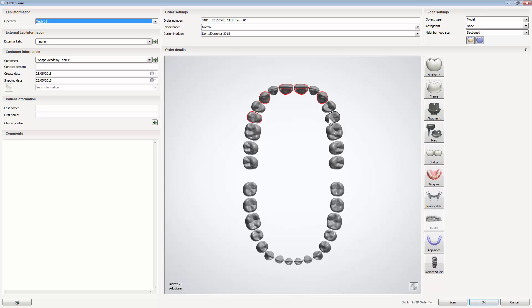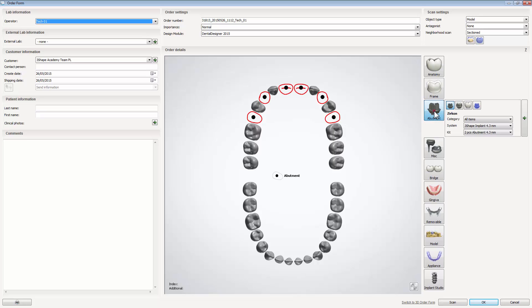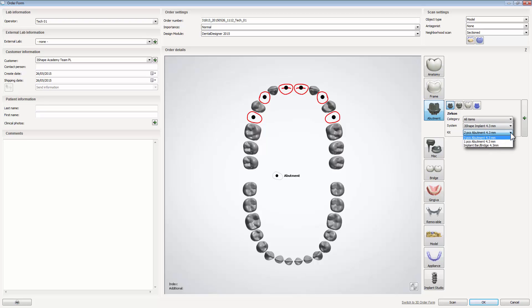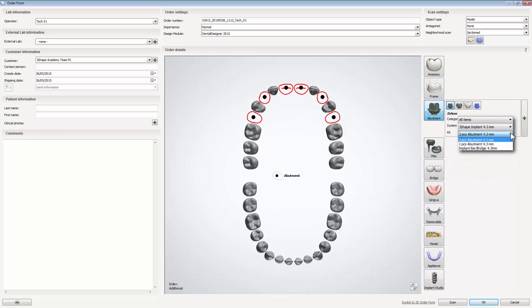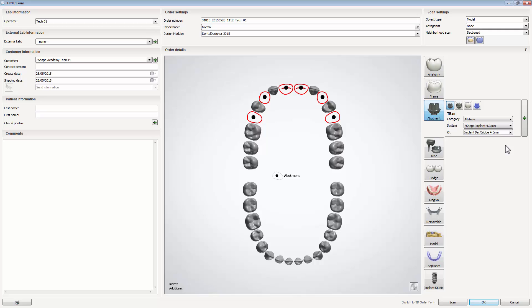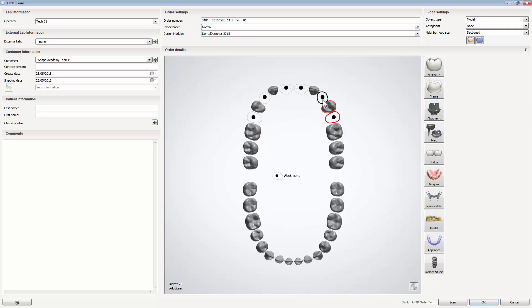Mark the teeth you are going to work on and select abutment. Remember to choose the right type of implant system and kit. While scanning, always use a corresponding scan plug which must be screwed to the model.